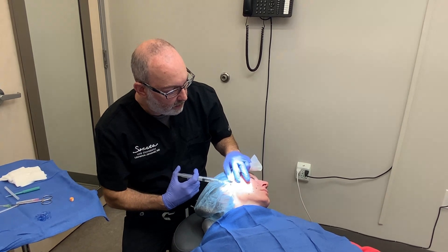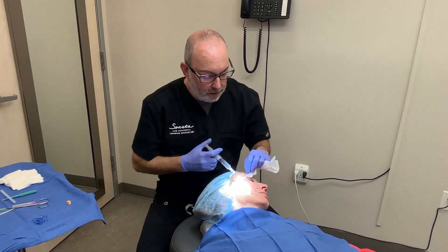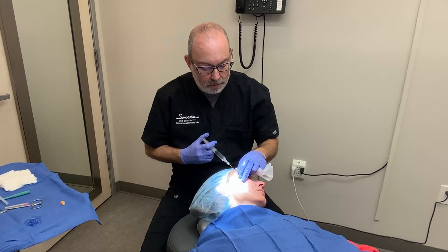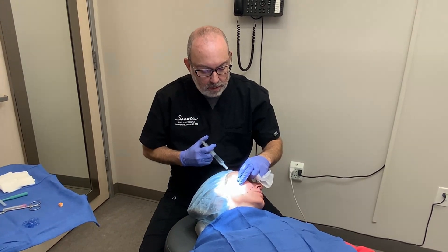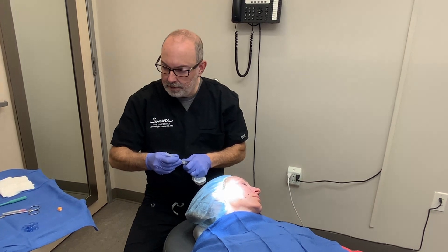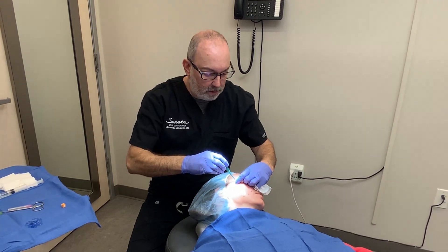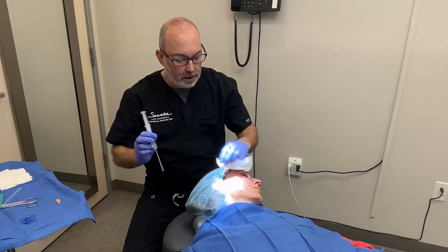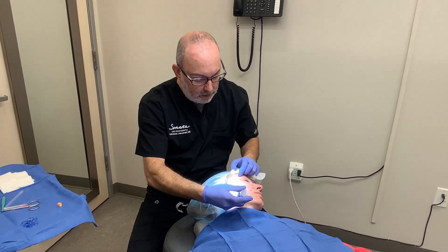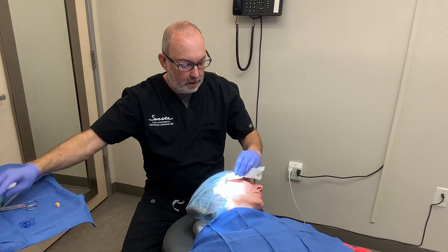We're putting a little bit in with each track. You can see I'm going to be crossing over, and then the third one is going to go down, which will cross over the ones that are going to cross. The only one I'm going to numb up without this needle is the temple because there's too many vessels, so we're going to switch to a 22 cannula and do a little bit in the temporal area. That was about five cc's for the whole thing.